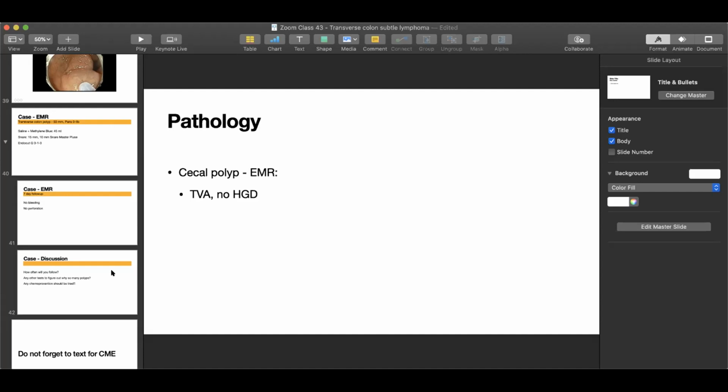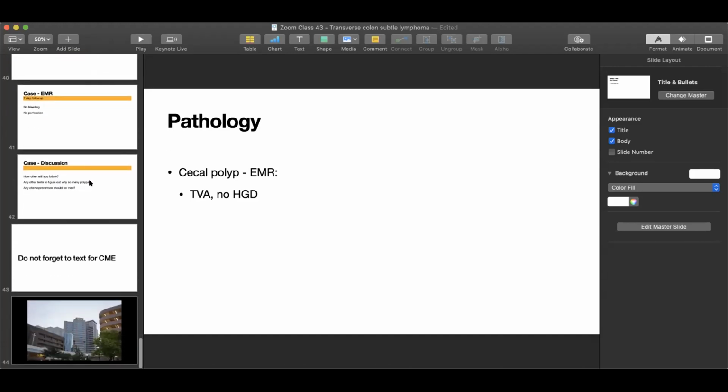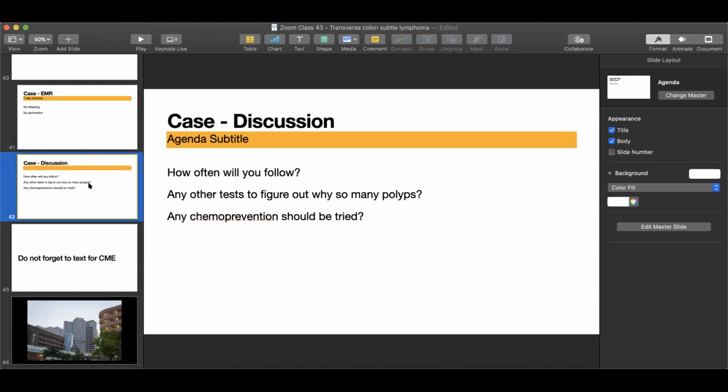Yeah. So let me first thank Sylvia, and Dayali for bringing in the slides. She didn't have an opportunity to dig through the previous slides, and maybe we can go back and look at her original resection that was done in 2018 to see whether it was a tubular villous adenoma or whether there's a serrated polyp. I think that would help us. We will do that. Thank you so much. It's a very, very tough case. That's the reason I've brought it, so that people could help us figure out how to help this patient, because at the end of the day, we have with us some of the best minds in the world. So we will look at the previous slides also.